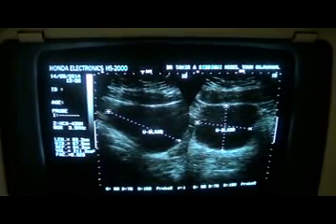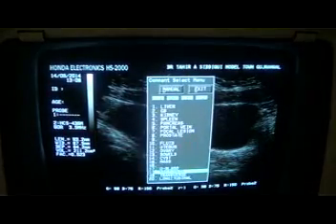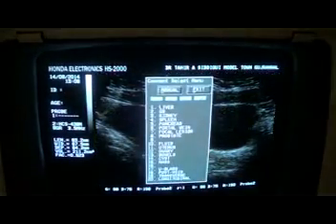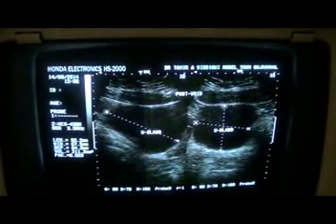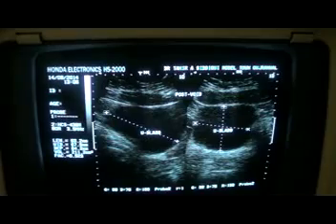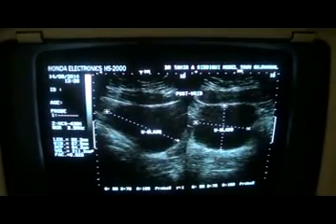Now, so the post-micturition or post-void residual volume is raised even after the procedure, the surgical procedure or the interventional technique that has been used, that of placing the stent in the urinary bladder.